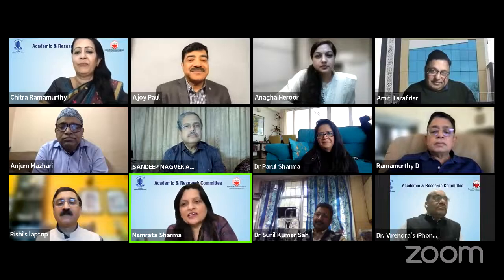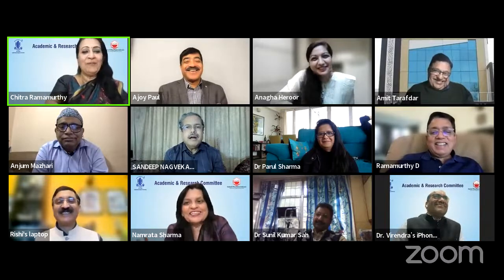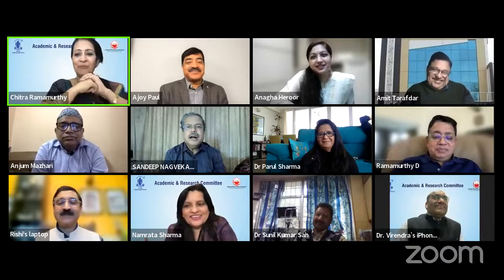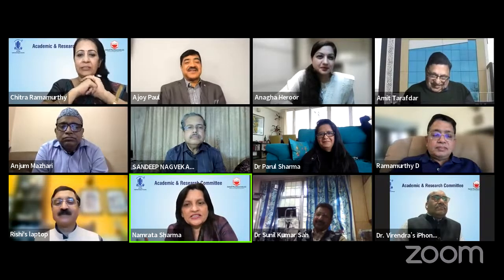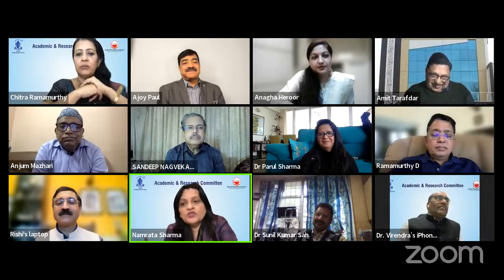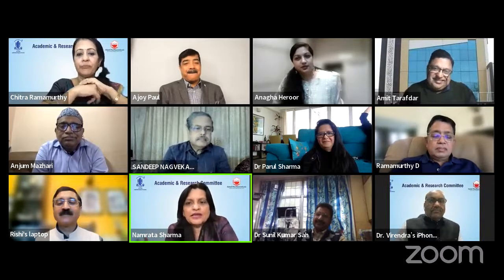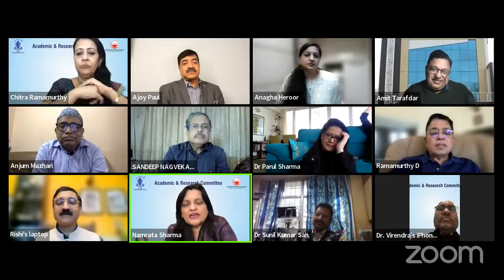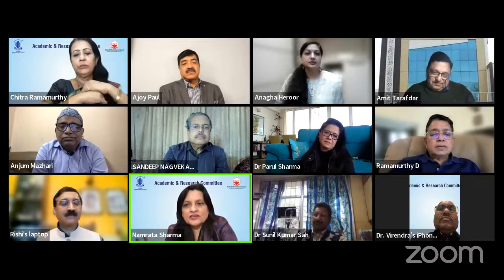So Chitra, you've answered that question very well. We would do exactly what you are saying, and Dr. Ramamurthy agrees. Very rightly said, we would first do the repair. Here it was a small tear, the Seidel's was negative, and Dr. Anjum was very lucky to have gotten away without having to address the astigmatism that may have arisen because of that. But I think that is the way. Customarily, we would first repair it, wait for some time for the cornea to stabilize, then calculate the IOL power, and then do intraocular lens implantation.